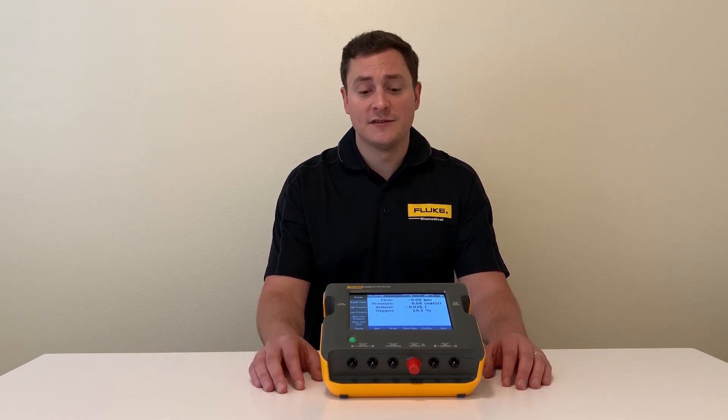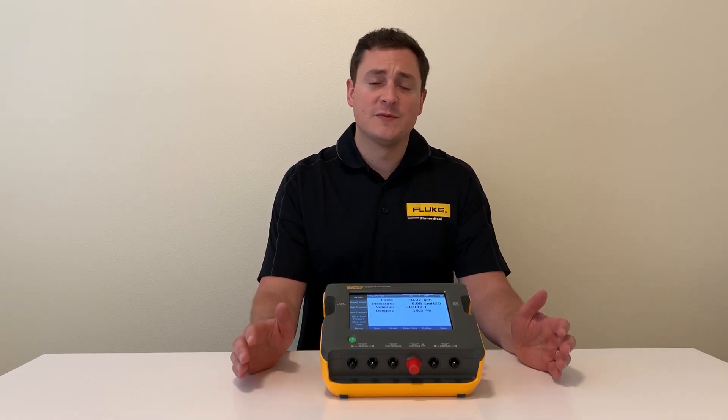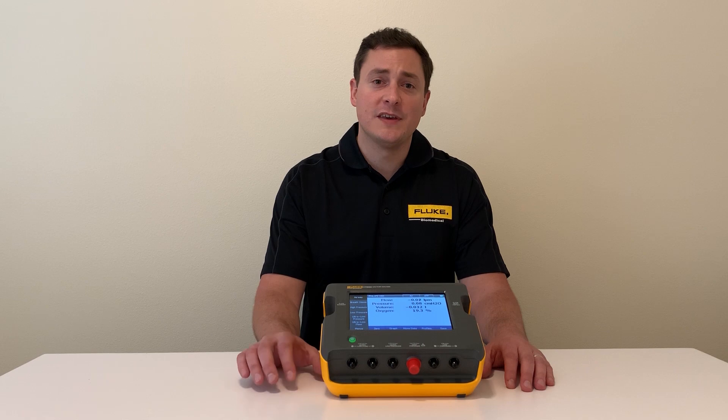To do that, you're going to need a gas flow analyzer, and in front of me I have the VT900A. Fluke Biomedical has packed some great innovation into this product to make your incoming inspections go faster and easier.